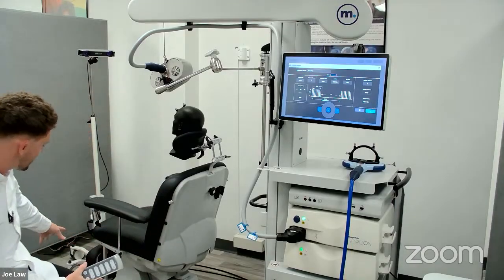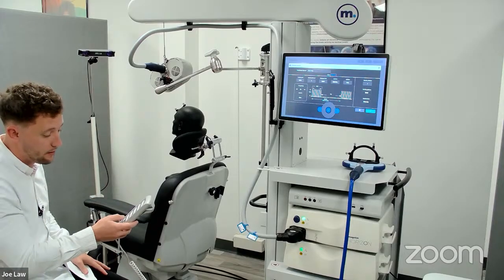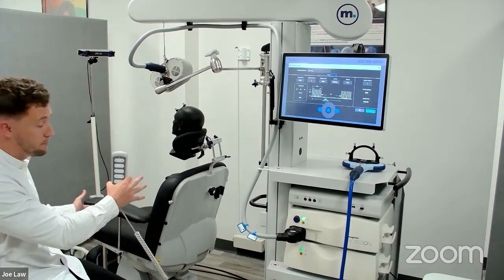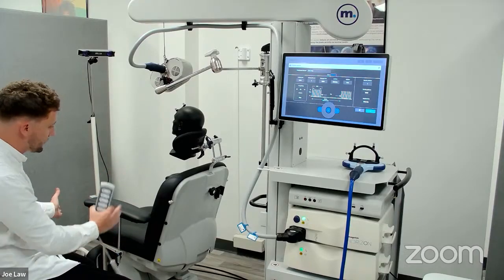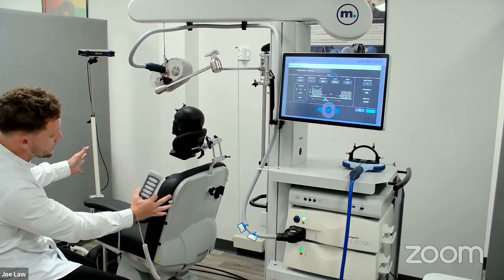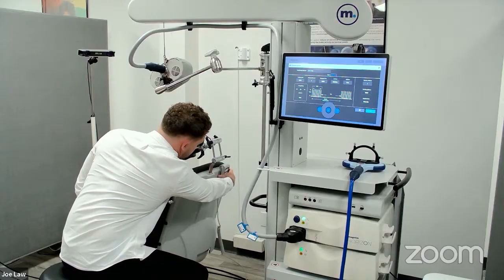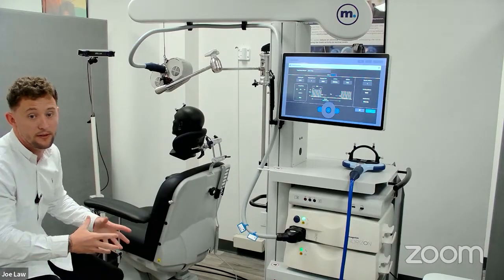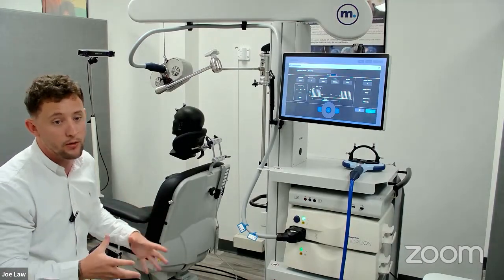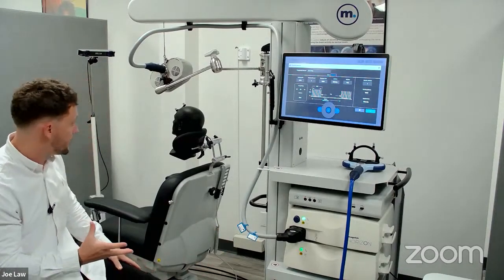We've got a footrest down the bottom for patient comfort that will also go up and down. And then we can tilt the chair as a whole. So if you don't want to do the back or the foot individually, you can tilt the entire chair backwards. A couple of other things you can adjust: the chair and the system are on wheels, so if you ever need to move the system out of the way, or adjust the position of the patient in the chair, you can move the chair.